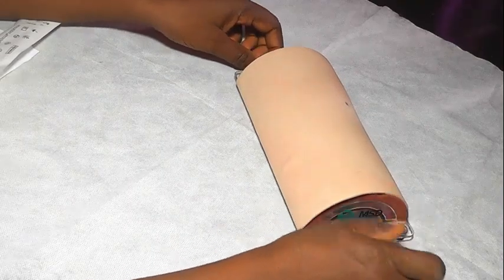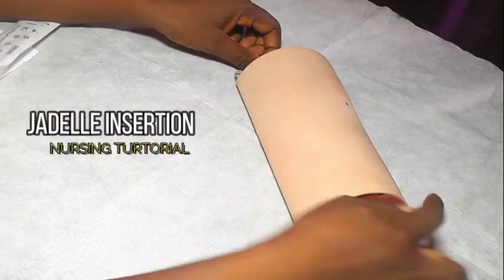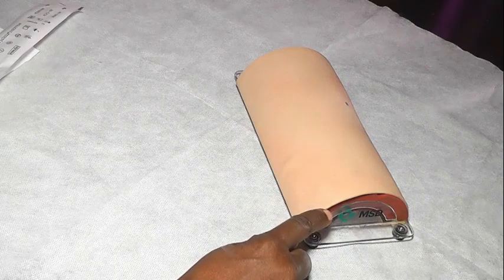Now the insertion is usually done at the inner aspect of the arm. You can see this is the inner aspect of the arm, and then this is the outer aspect of the arm. So you take your measurement for the insertion. Now it's usually 6 to 8 centimeters away from the elbow joint.